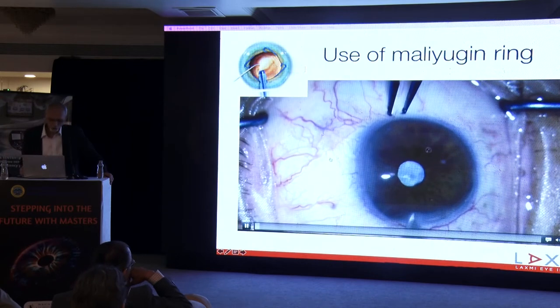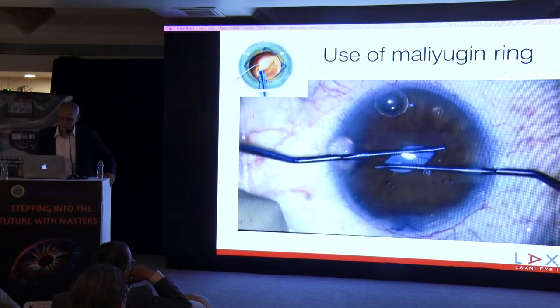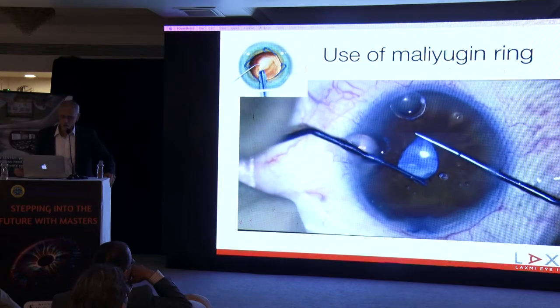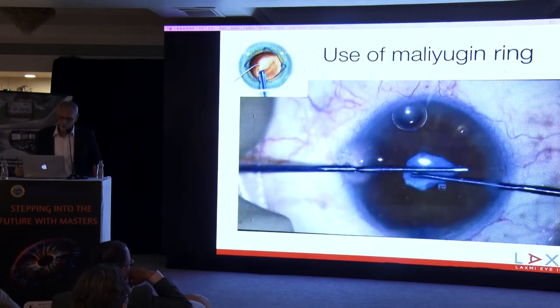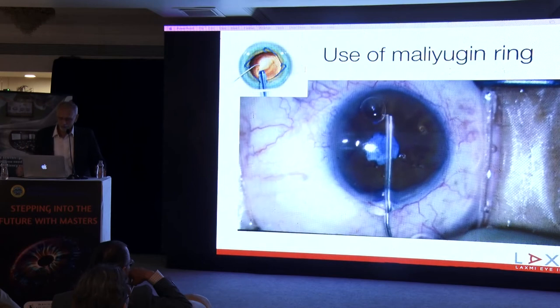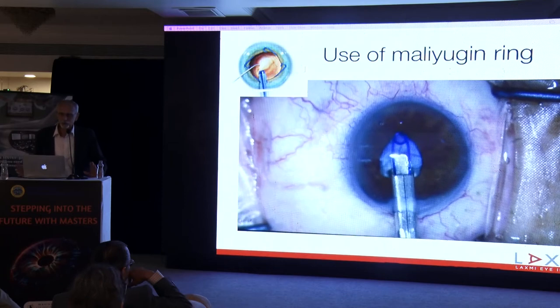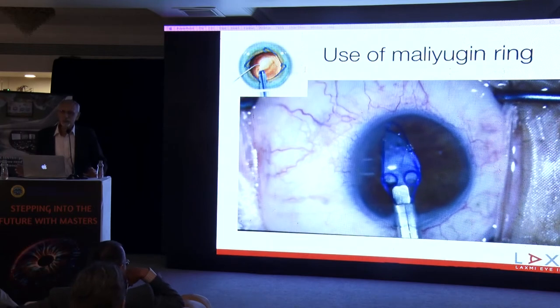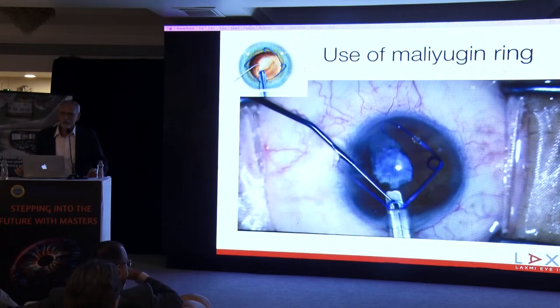Now this is a small pupil, and definitely this is also a rigid pupil. When you have a rigid or small pupil and you try to do stretch pupilloplasty, do it very softly, because when you use a lot of force, there's a tendency for the pupil to tear at different places. Of course, staining of the capsule in a small pupil is mandatory, and this kind of pupil asks for a slightly more rigid expander, and here I'm using Malyugin's ring.